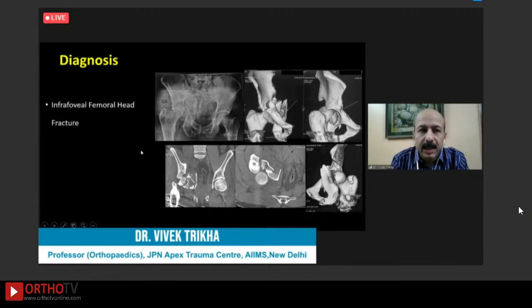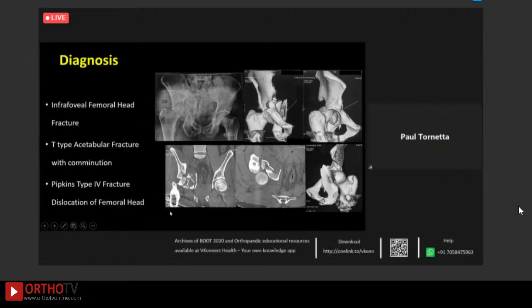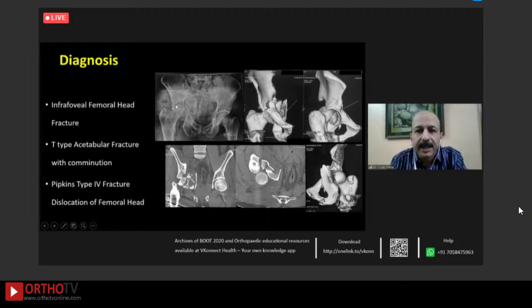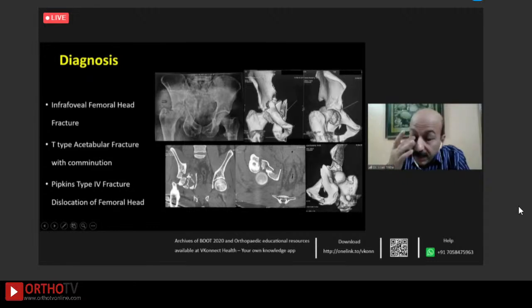So, any comments regarding this diagnosis as well as the fracture pattern? I mean, that's a tough problem just because you hate to see a femoral head injured like that. And you can really see it pretty clearly in your upper left image. You see that head injury, which you saw in the initial film as well. Yeah, I think you have to decide, how old was the patient? I missed that. He's 26, a soldier who has come back to his hometown for his vacation.